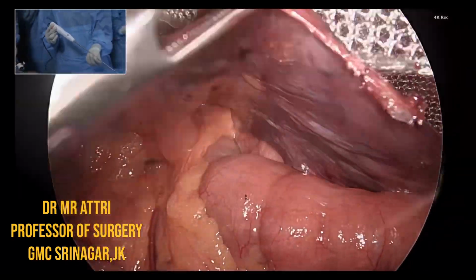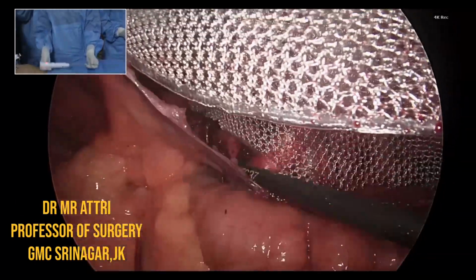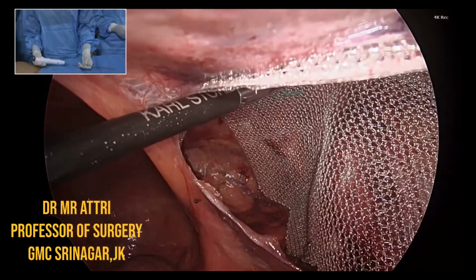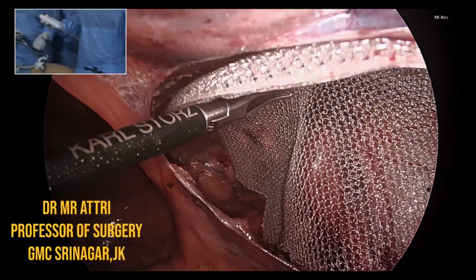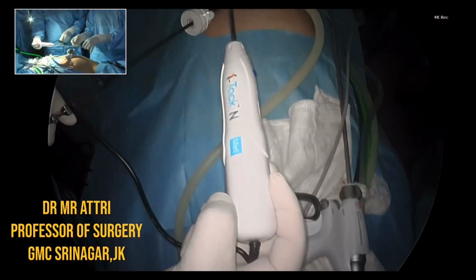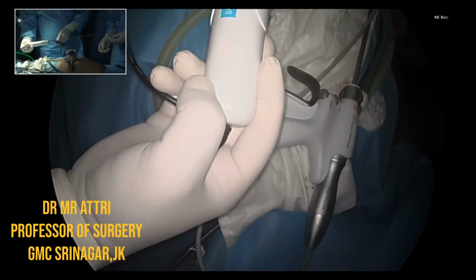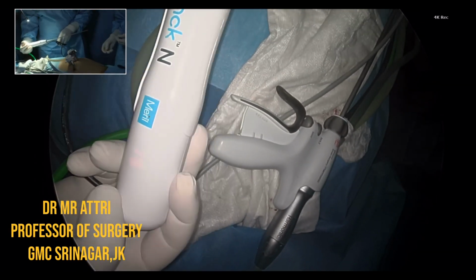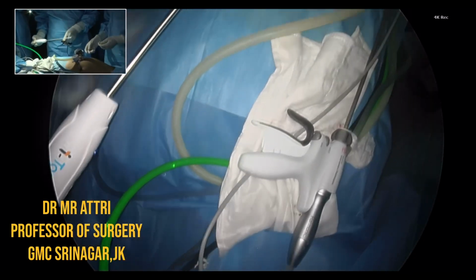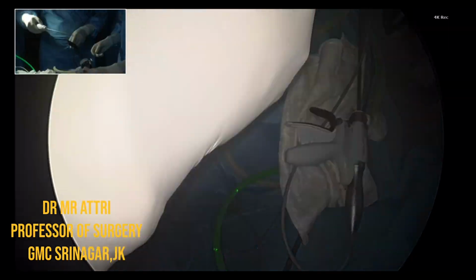So again and again I am watching the inferior margin of the mesh. That's the most important thing. And we had very tough adhesions with the vas. Give me tacker please. Move the camera. So this is the tacker from Merrill. It has a marker. It is written 15 here. Can you see it? 15. It is just a powered operated tacker, and we have to just press this button and it fires. Let's see how it goes inside.